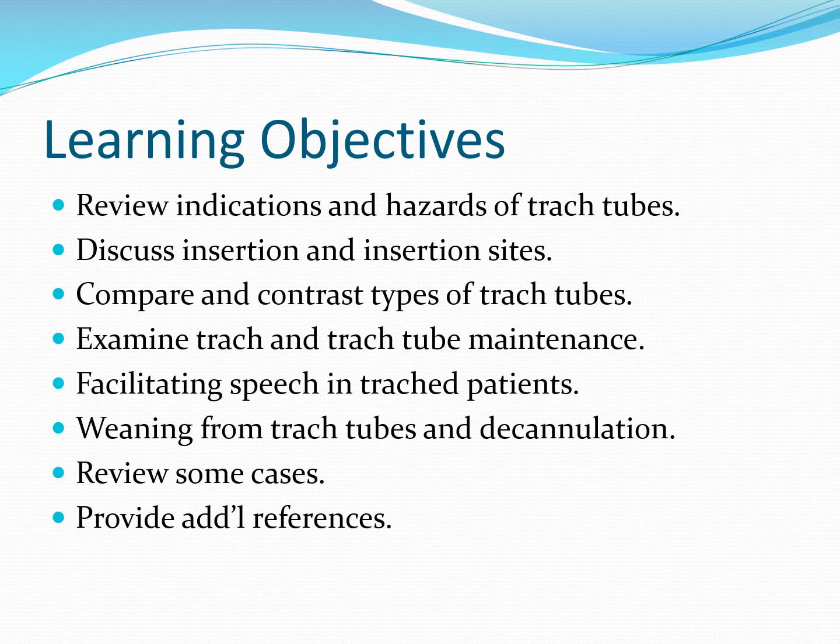We'll also broach the topic of facilitating speech in tracheostomized patients. Furthermore, we'll discuss weaning from trach tubes with the eventual goal of decannulation. And decannulation is a fancy term for the removal of the tracheostomy tube in a planned and controlled manner. We'll also review some case studies, and in addition, I'll provide you with additional references and resources for those who want to drill down more and learn more about this topic.